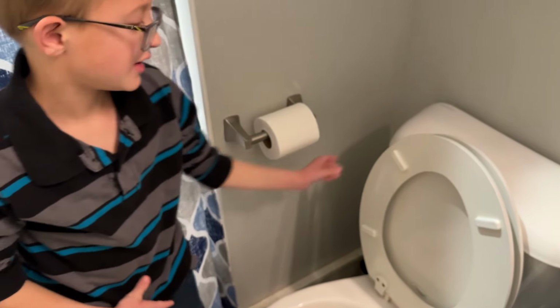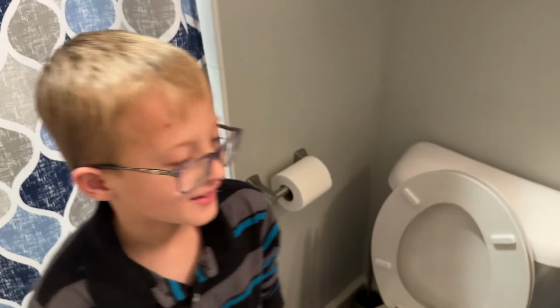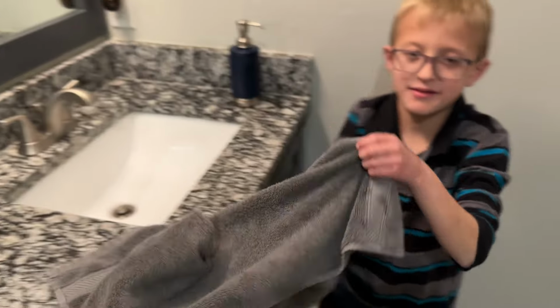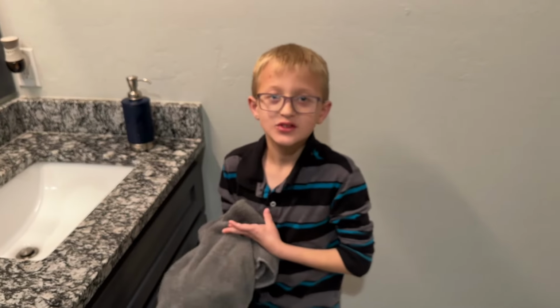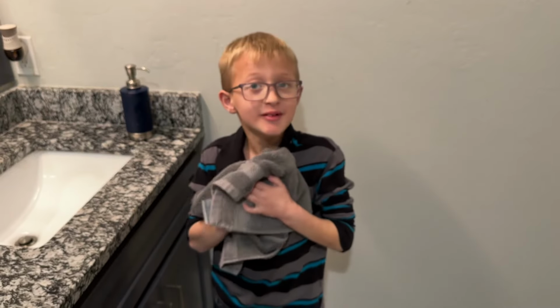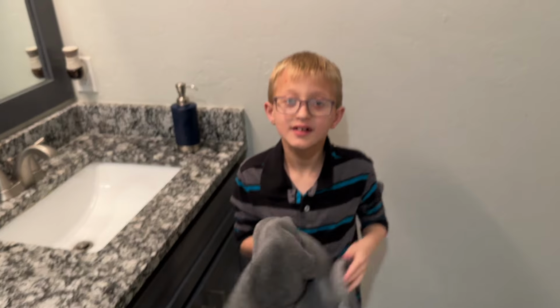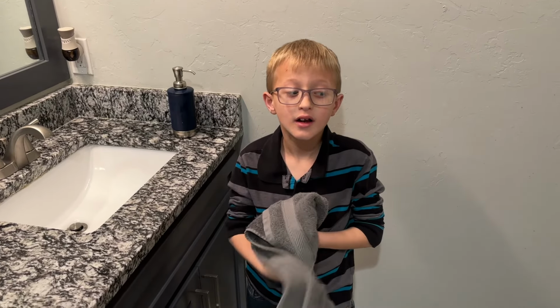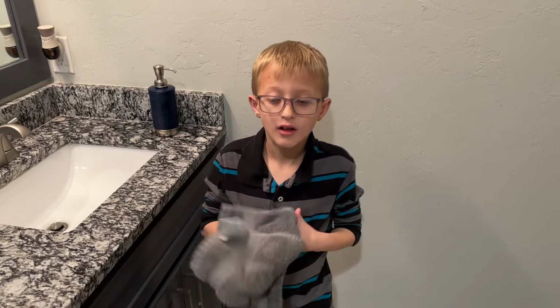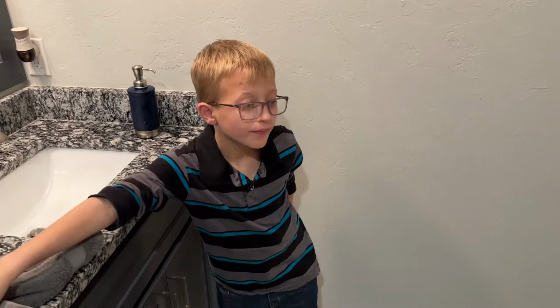Great. And then we just flush that toilet and wash our hands again, right? Yep. Go ahead and do that again. And then we just dry like we did before. That's right. Very easy, right? Yep, super simple. So again, cathing, very simple. It doesn't have to be perfect and sterile, just clean. We just stick the catheter in, pee comes out, we take it out, and we're all done. Can go 4 hours in between cathing, which is perfect.